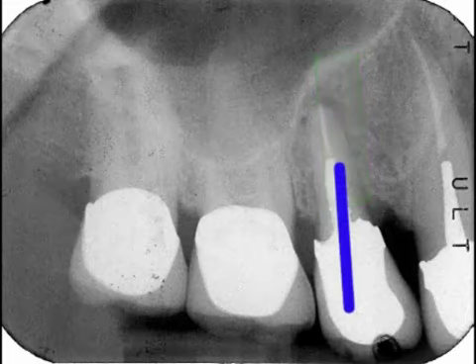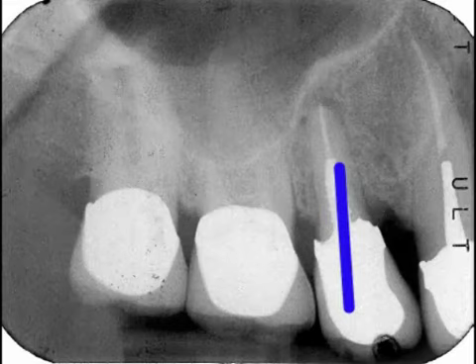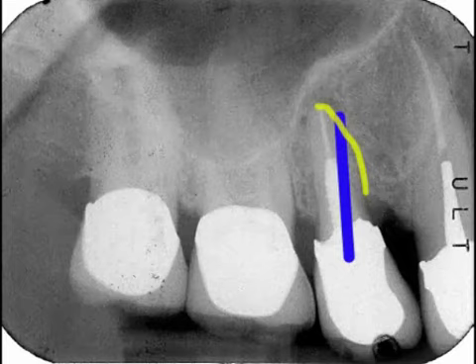So if we're going to do this freehand, what we're going to do with our round burr and then our 2.0 twist drill is try to angle this implant in the correct orientation and position, and we're going to have to be really careful that as the burr contacts the mesial slope of the socket, it doesn't deflect posteriorly and the implant ends up staying right in the extraction socket and not where we really wanted it to go.